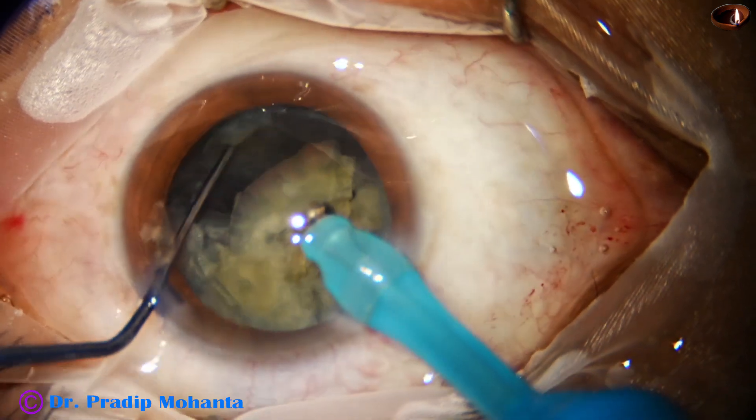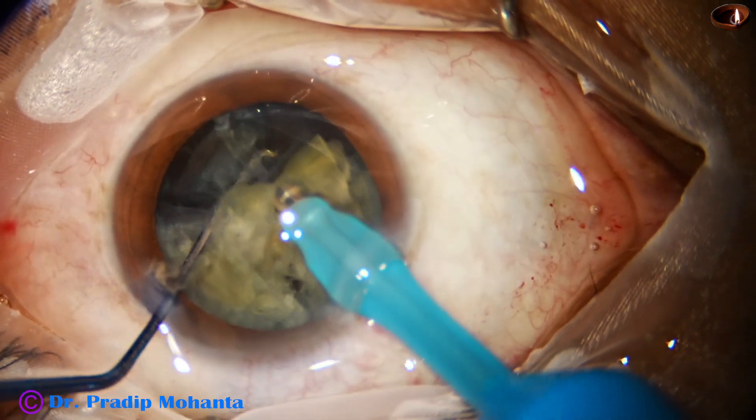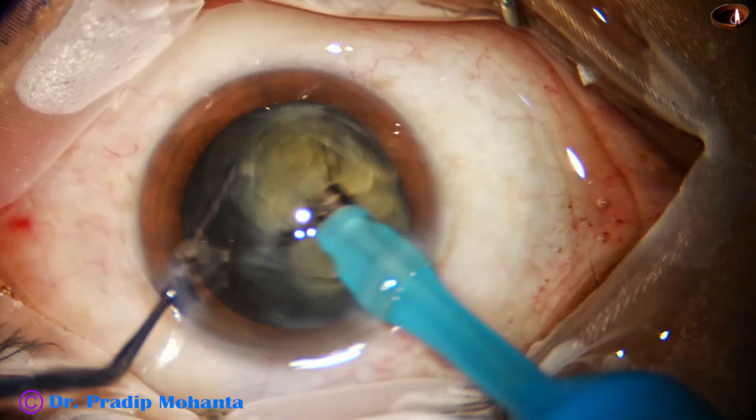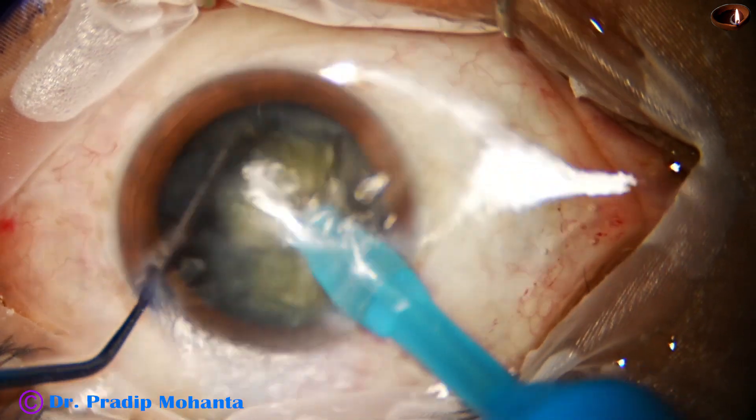The epinucleus is detached and kept at a distance. The nucleus is emulsified, and then the epinucleus comes to the tip.